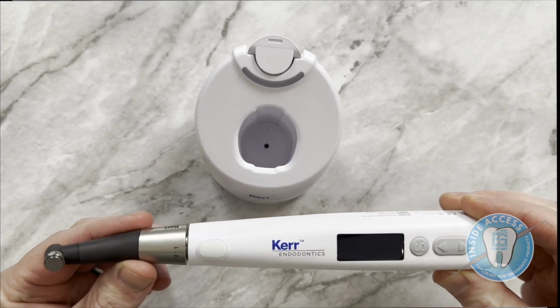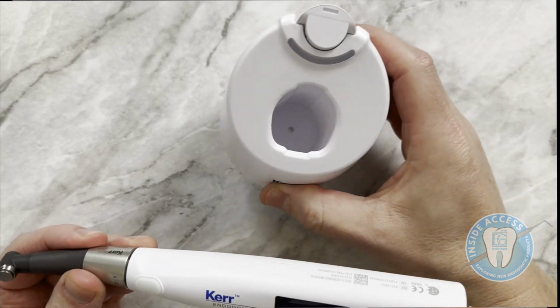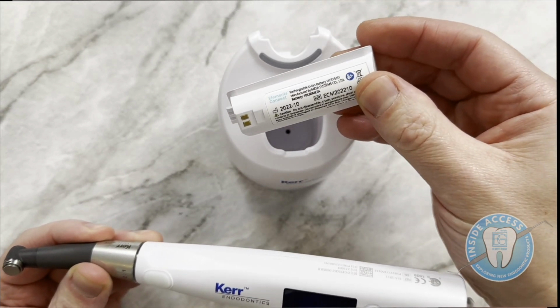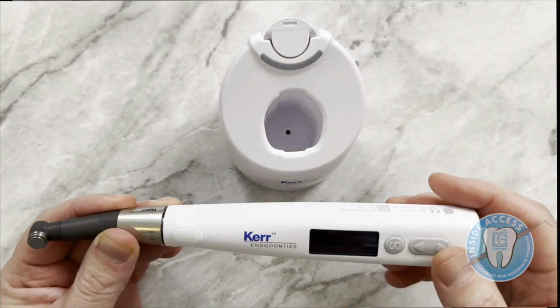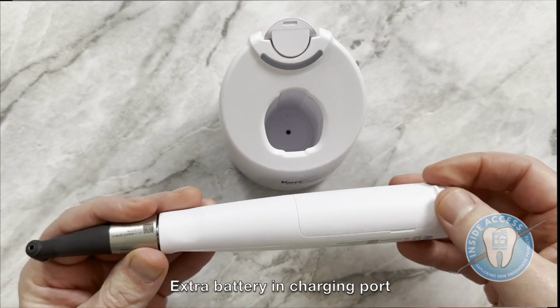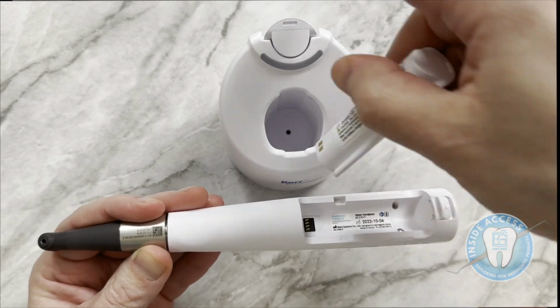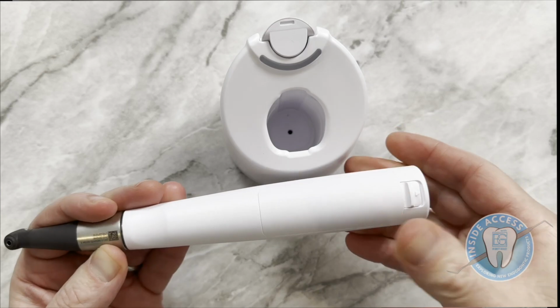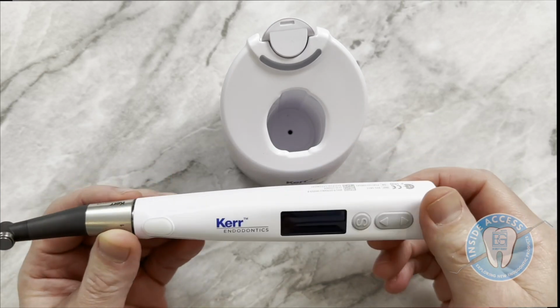Okay, let's take a look at the Elements Connect. This is the motor, and this has some cool functions. So this is the base, and again, it does charge, but it charges through this battery port here. So you have an extra battery always charging, and it's easy to just essentially flip the battery out. And if you were to run out of charge, just replace these and bring this right back in here, just like so.